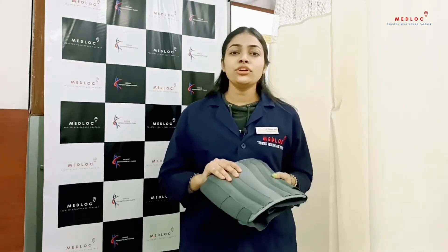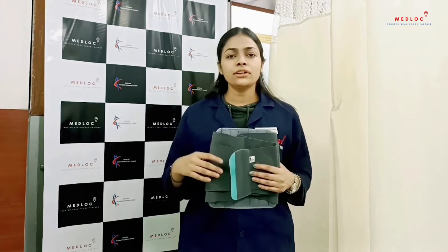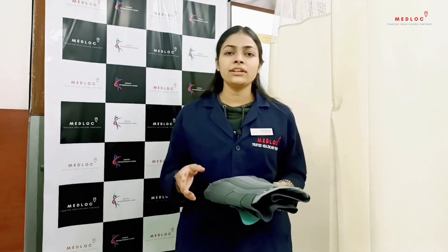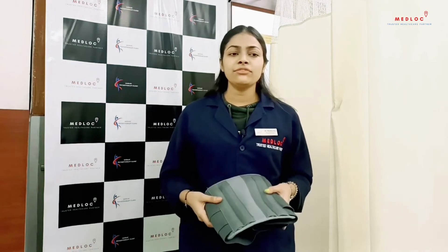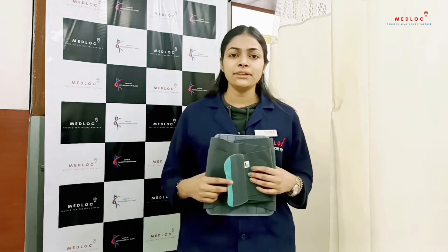You must keep in mind that you should avoid wearing it 24 hours, 7 days a week. Don't wear it the whole day long — wear it only when you do strenuous activities which put stress on your back. It is not recommended to sleep with the lumbar belt on; remove it while sleeping.